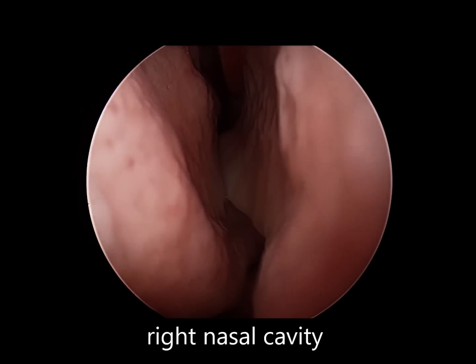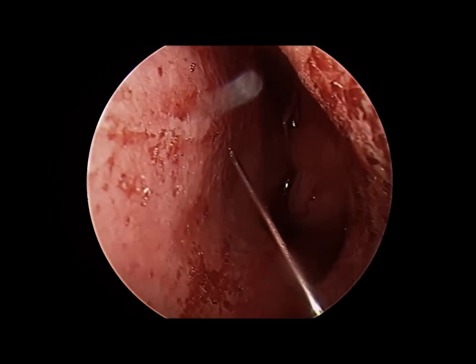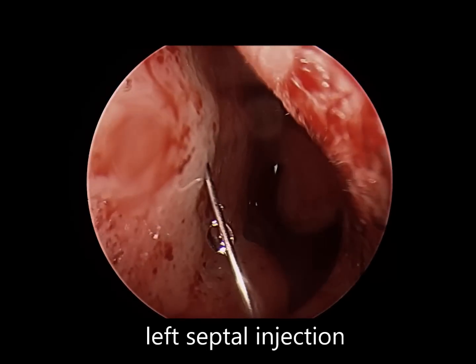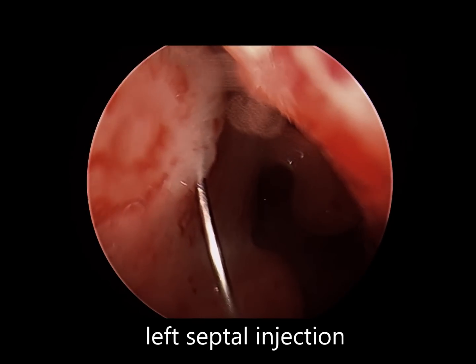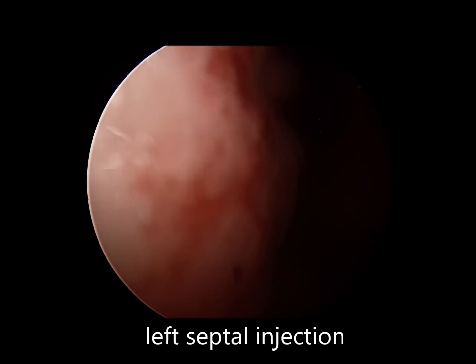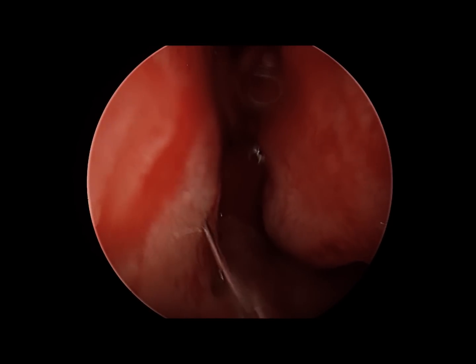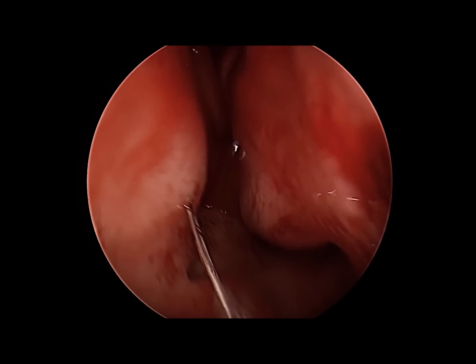We'll tend to approach the patient's septum from the more concave side, which in this image would be from the patient's left side. And here we are injecting the patient's septum, typically taking the needle and passing it into the cartilage slightly, and then backing it out while applying pressure to the plunger to allow the injection to find a submucoperichondrial plane and dissect along the tissue and perform some hydrodissection for us.